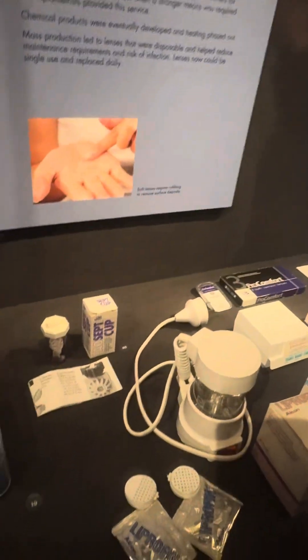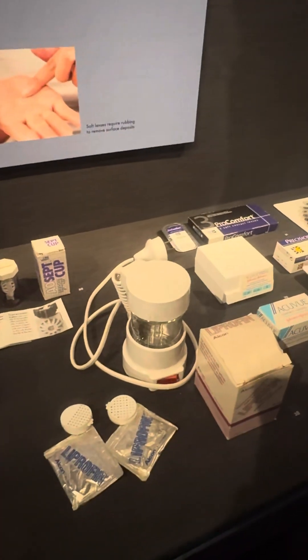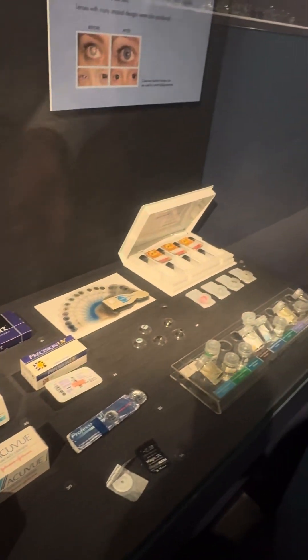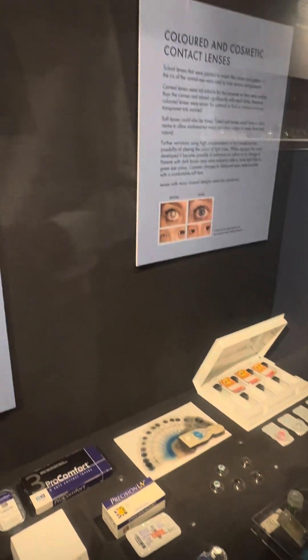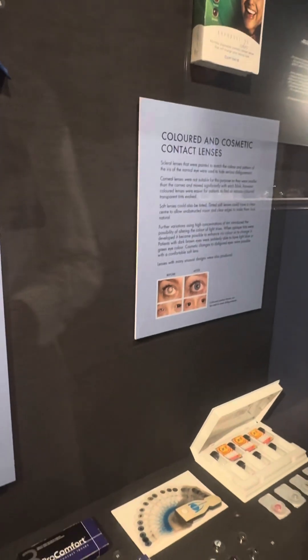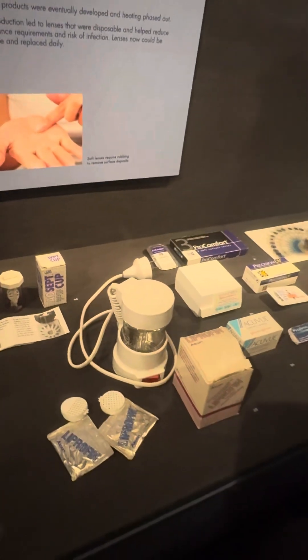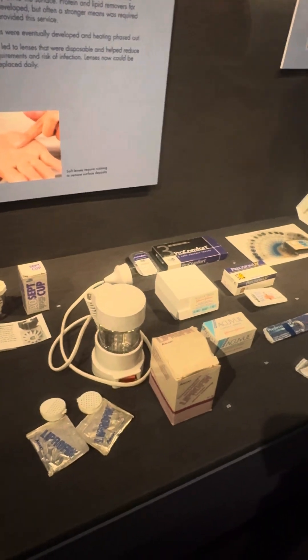Manufacturing became more and more specialized. Nowadays some of those are one-day disposables — you put them in in the morning and throw them away at night. And there are some that, if monitored very carefully, can be left in the eye for longer periods.